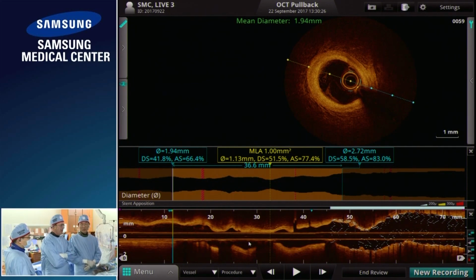Yeah, physiologically it may be significant, but clinically, in the LAD CTO, he's just functional class 2. So he'll be asymptomatic, and I will test him one month later. I suspect he will be left with a degree of significant anteroapical ischemia. Do all agree with the leave-alone strategy?